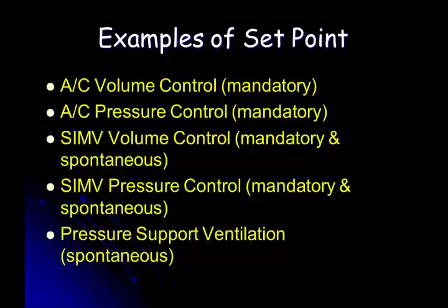So a lot of these modes that we'll talk about are set point. Assist control, volume control. Assist control means what? You've heard that term before.